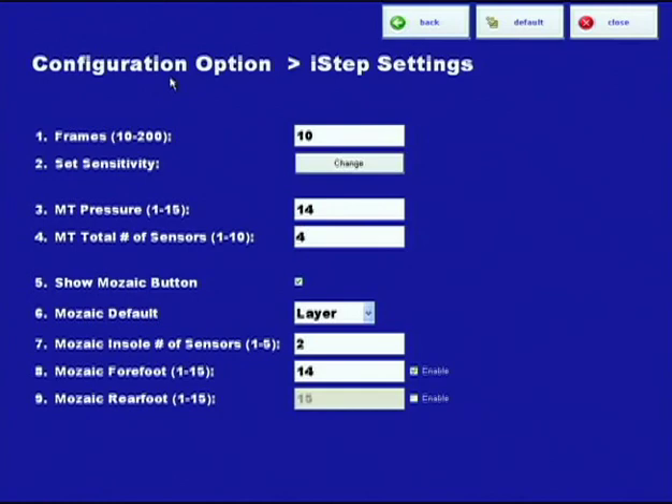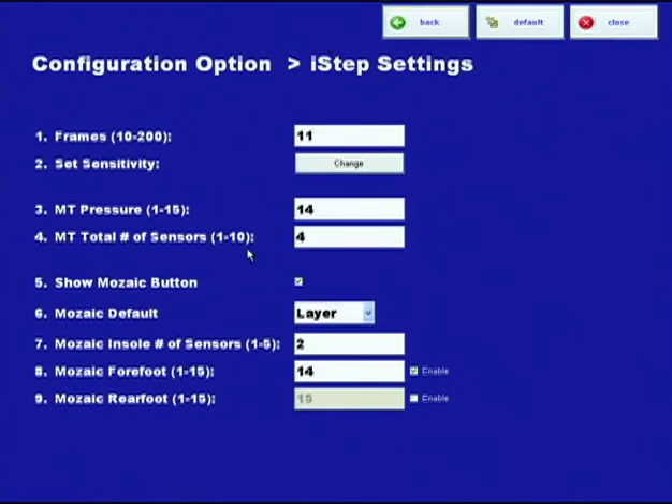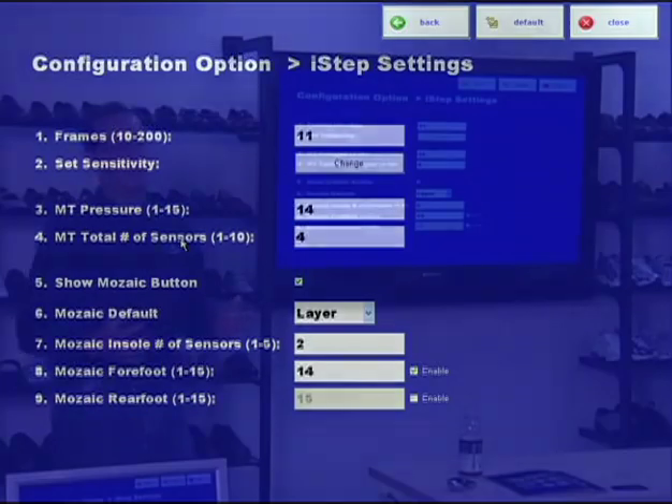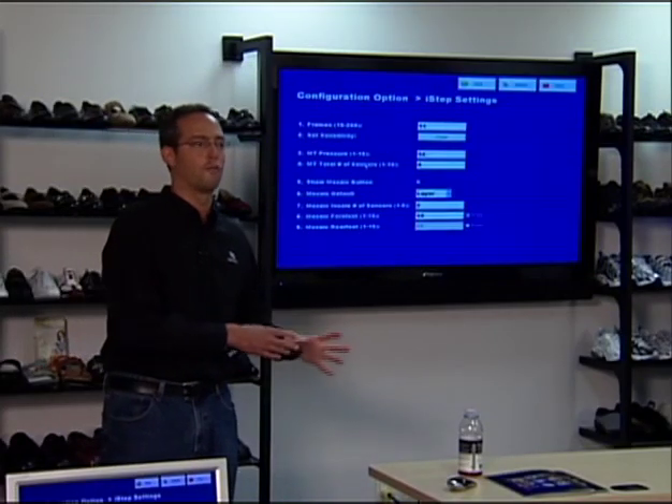The countdown. So let's change it so you can see that you can change it. Set it to 11. We'll hit save. The options are 10 to 200. The most common is 10 to 20. I don't think I've ever met anybody that uses it over 30 seconds.